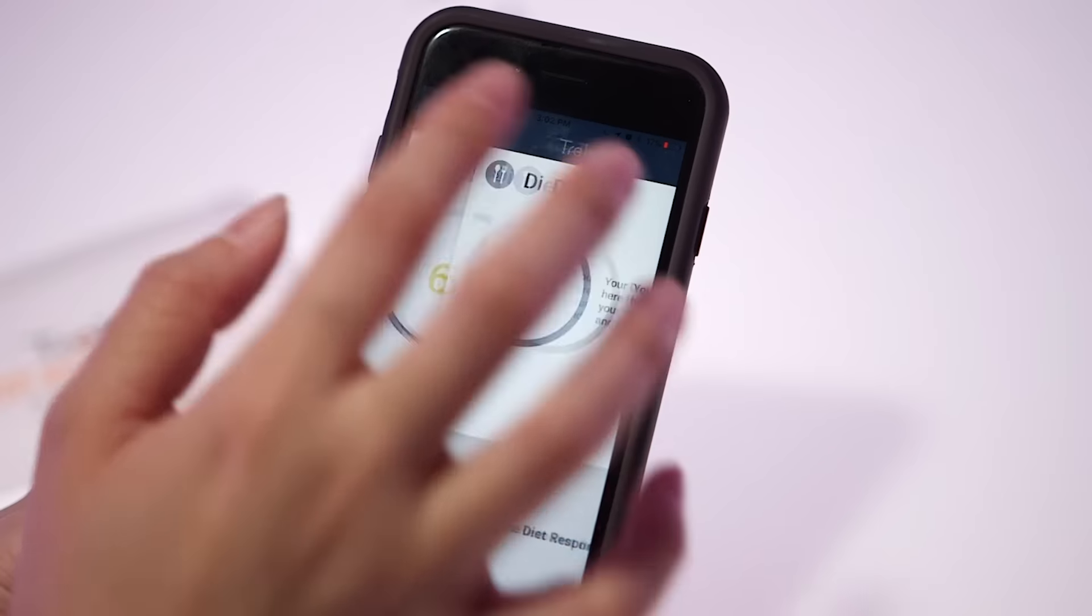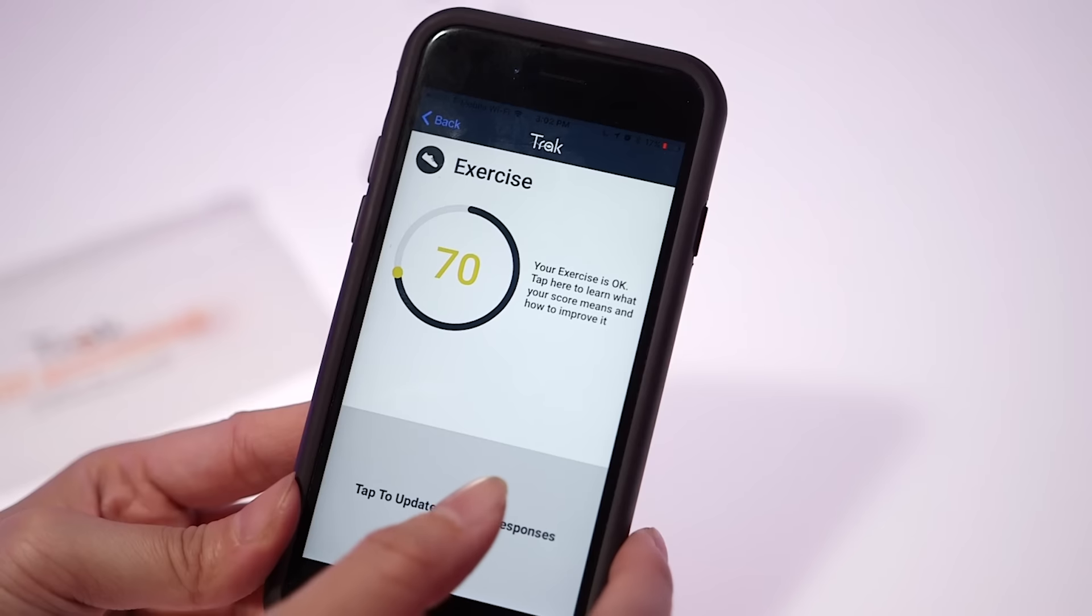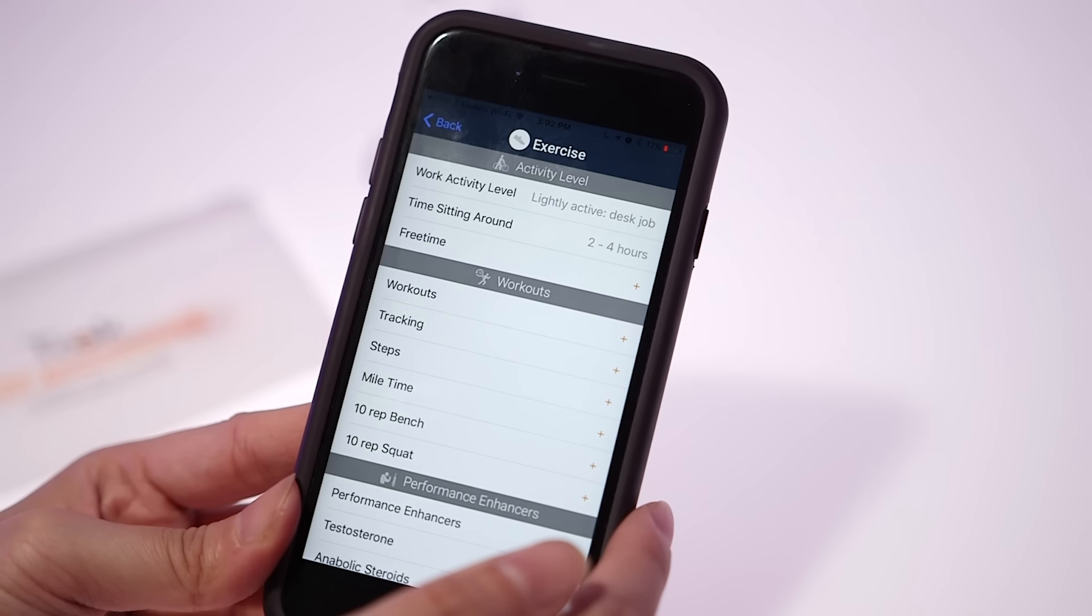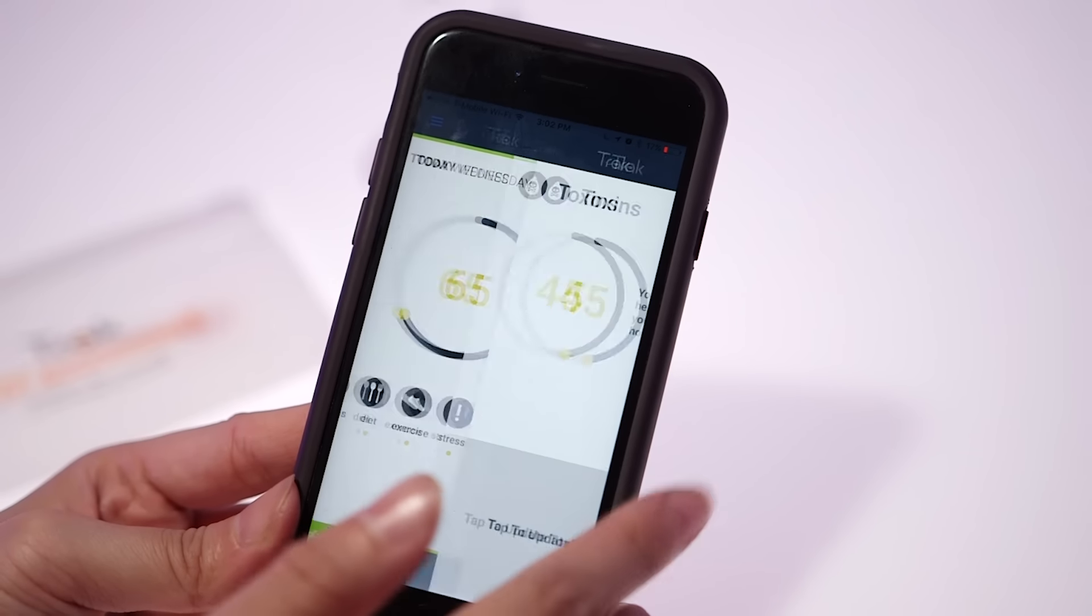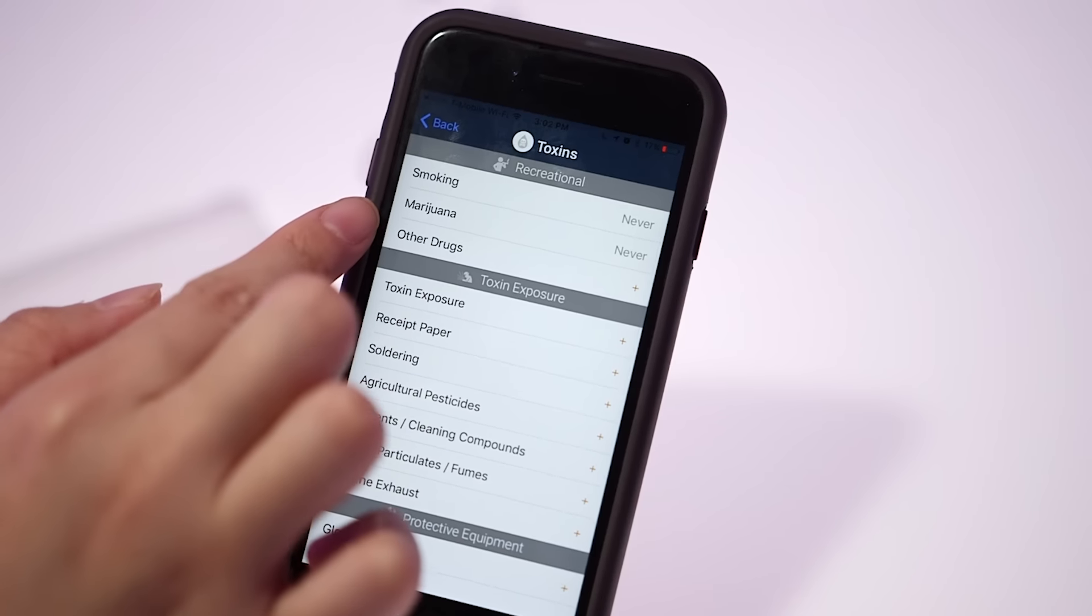This system also differs from others in that it teaches you how to improve your results. TRACK's companion app provides tips on how to increase production levels by adjusting factors that include diet, sleep, and exercise. Over time, you can see if your lifestyle changes have caused any differences to your sperm count.